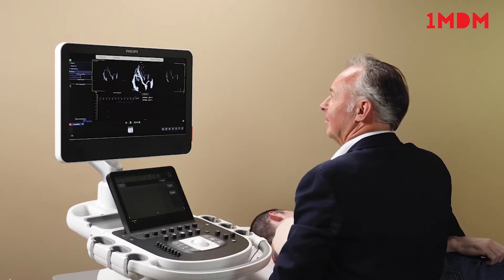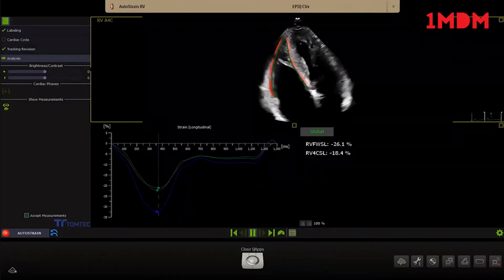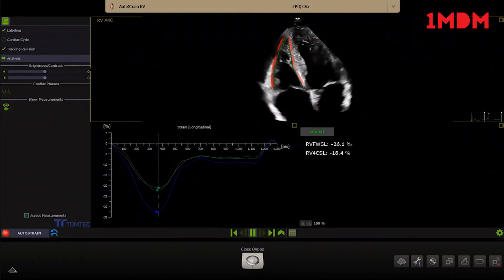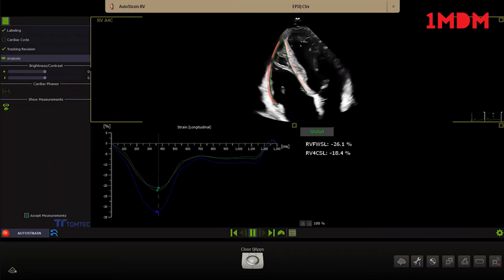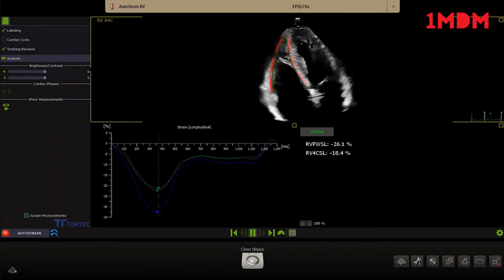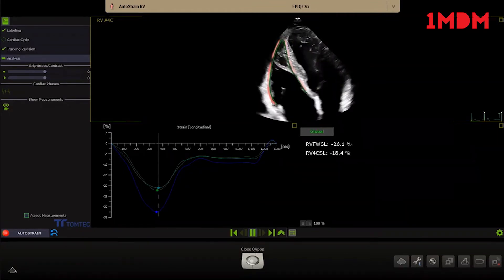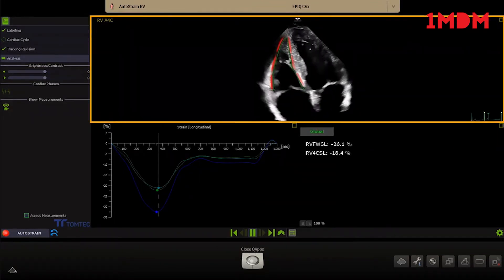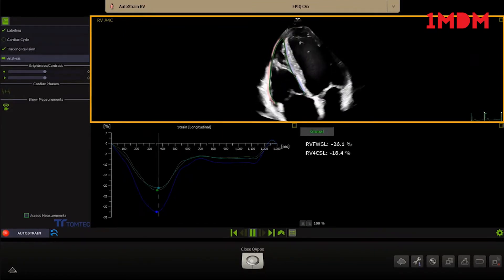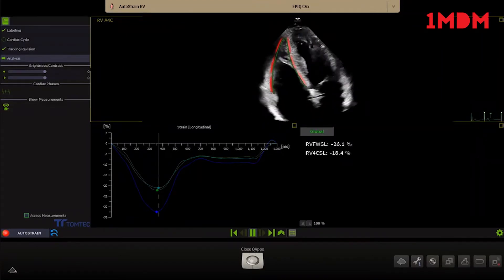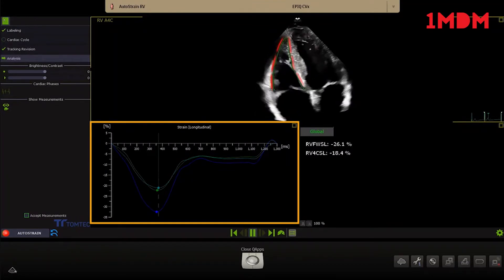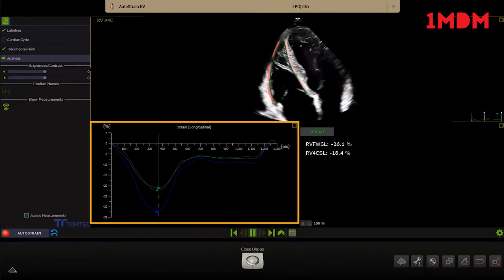The one-button-push Autostrain RV provides a fast and reproducible longitudinal strain measurement of the right ventricle. The AutoView recognition and Auto ROI placement algorithm automatically assigns the view label and places the contour of the right ventricle. On top you see the RV-focused apical 4 chamber view. The contour position and tracking can be reviewed on the dynamic 2D loop.